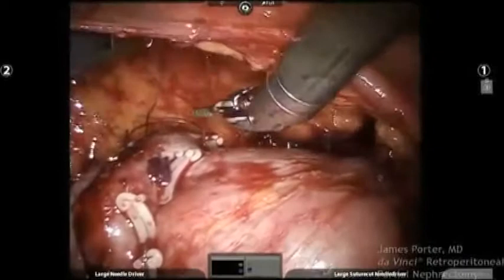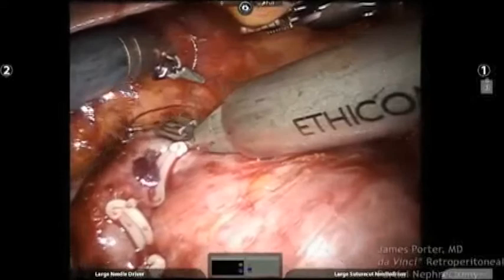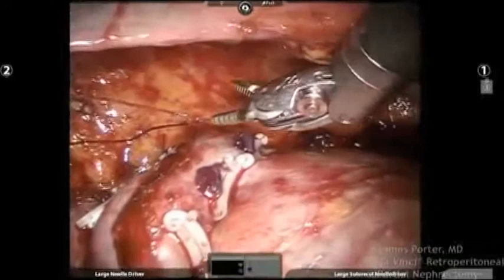With his ischemia time of only 15 minutes, I would have just completed the repair. It was so quick, as opposed to stopping and taking the clamps off. If I had concern and my time was higher, then I think I would. That's the reason why I personally don't have any experience with early unclamping.